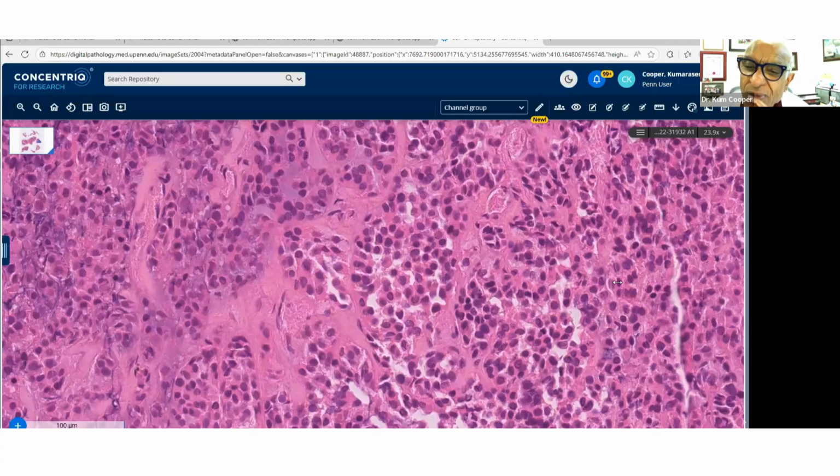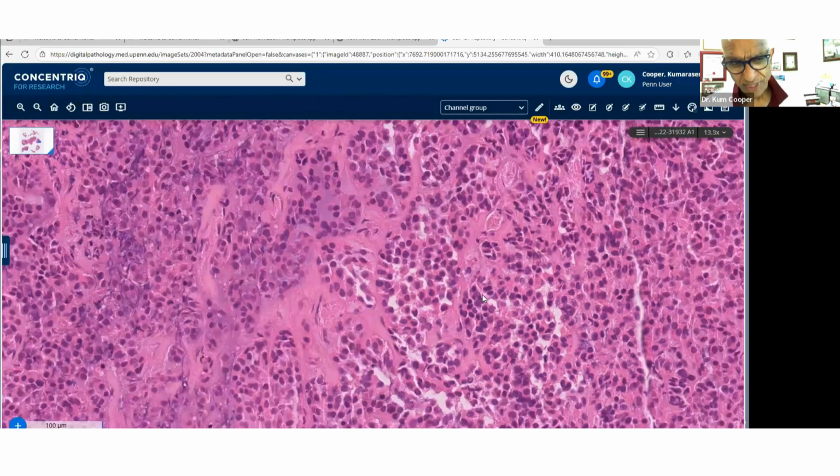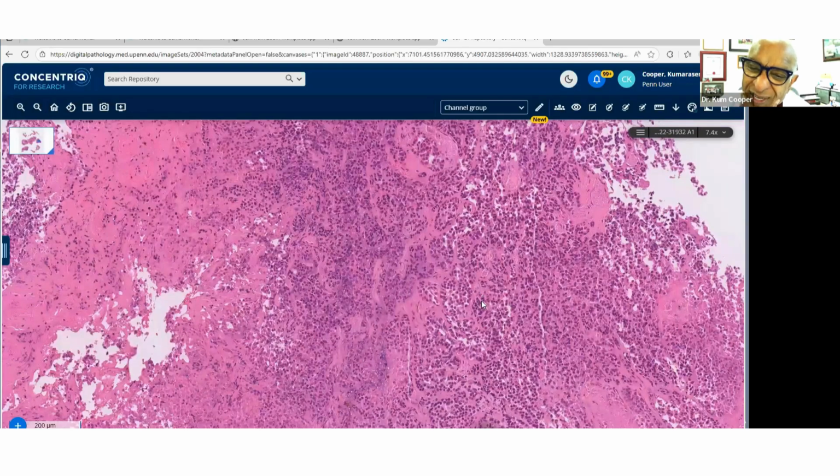There's a desmin here as well. And we did the actin and desmin, and I've given you that as negative. And then there's neuroendocrine tumor. Of course, the nested pattern does bring in the neuroendocrine story as well. I'm just wondering in that location whether you'd be thinking metastatic neuroendocrine tumor. So yeah, we're going to throw in the neuroendocrine markers.